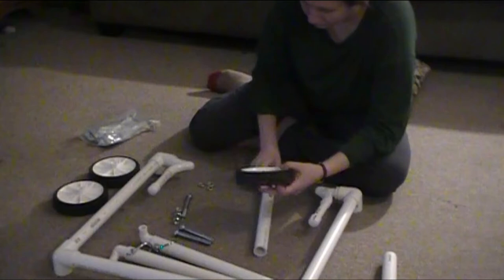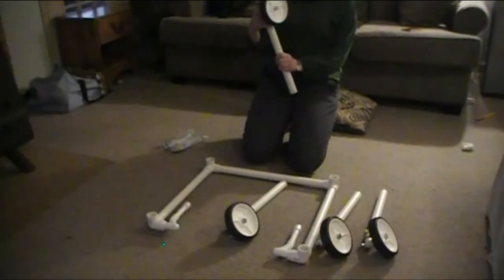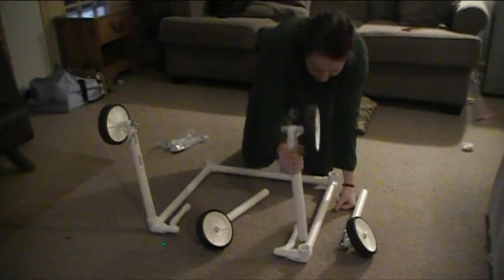Now assembling the bolt system for the wheels: it's a 5-inch bolt with a washer and a stop bolt. The stop bolt is especially important for pediatric patients because a regular bolt could come loose, pop off, and become ingestible. Stop bolts were specifically chosen for that safety reason.